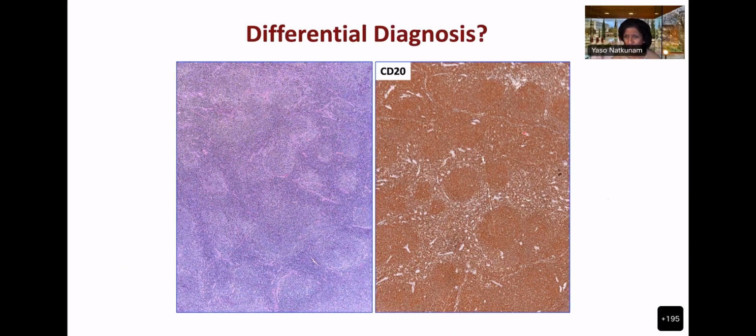So what am I trying to show here with the CD20 cells? But what about the B cells? If this were a tonsil or a normal reactive lymph node, would the CD20 look like this? So what does it look like? Lots of follicles. But what about all this?